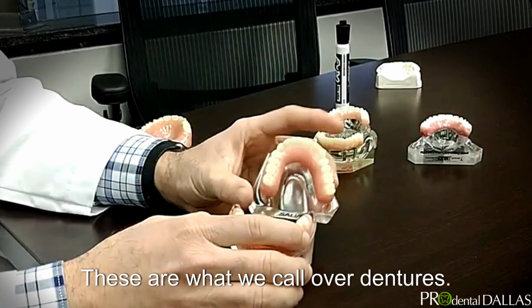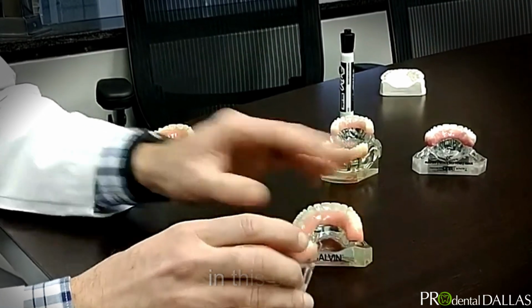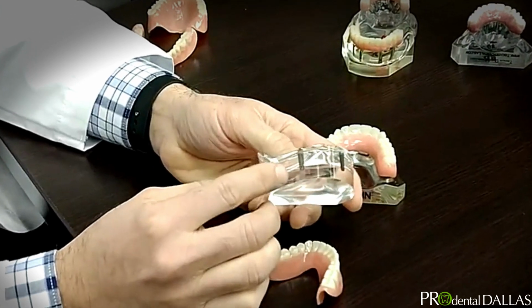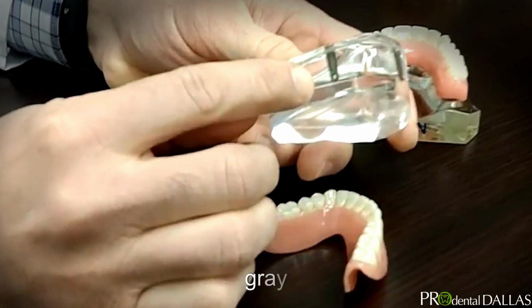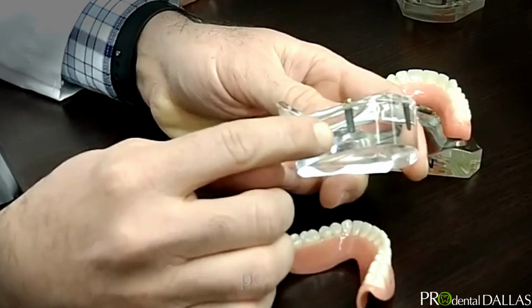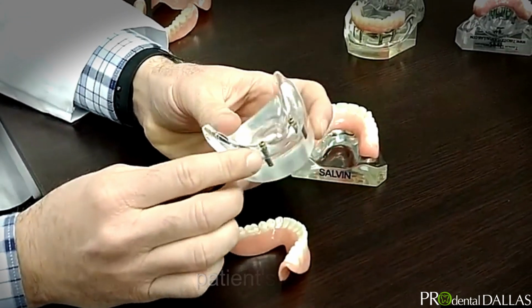These are what we call overdentures. They get their name because they're a denture that goes over something. And in this case, the denture goes over dental implants. These metal gray titanium posts are dental implants. And the dental implants are placed in the patient's bone.